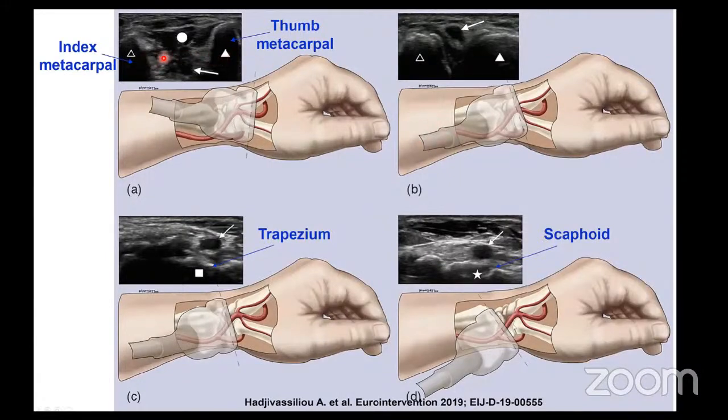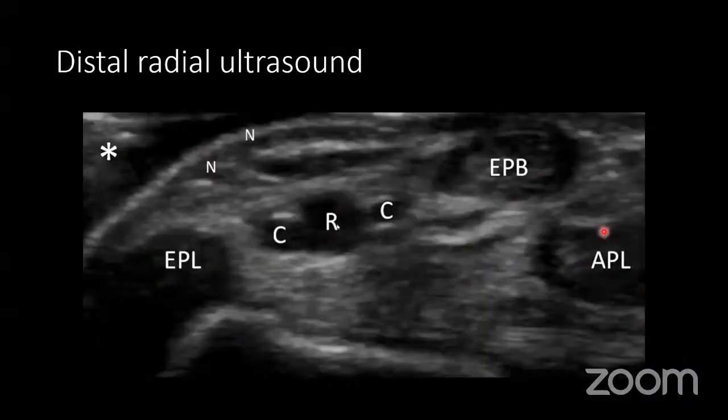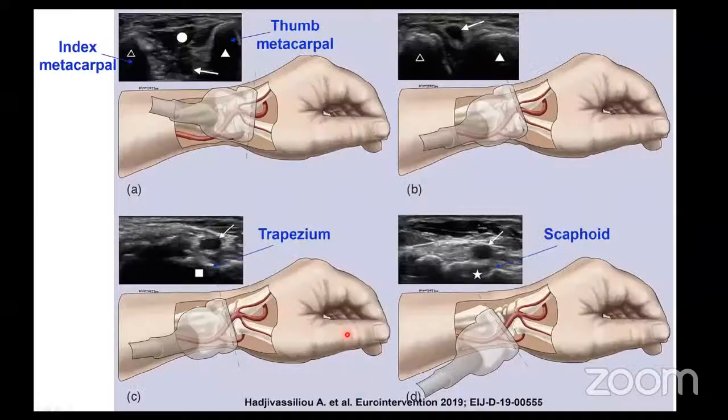First, we will identify two metacarpals, this metacarpal and this metacarpal. Then we'll be moving back, and we will identify the head of the two metacarpals. Then we will identify two bones. In between the two bones, we finally get this configuration.